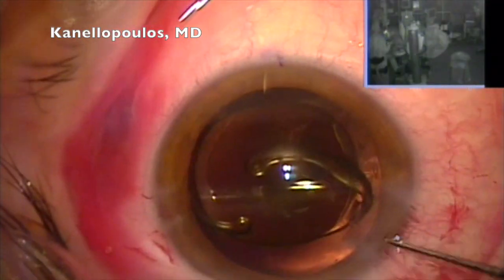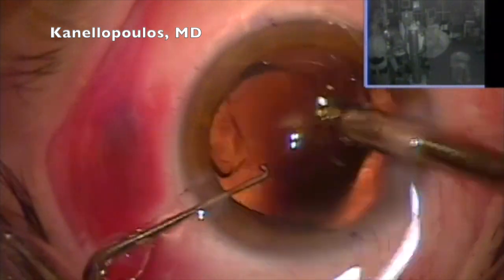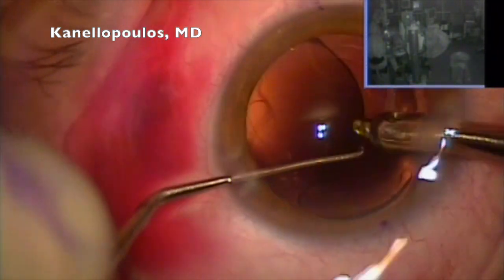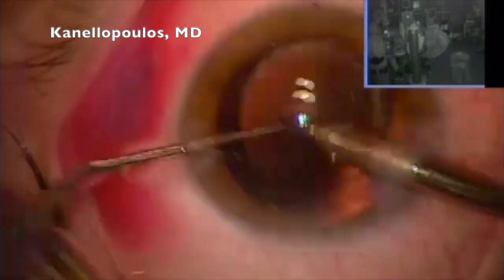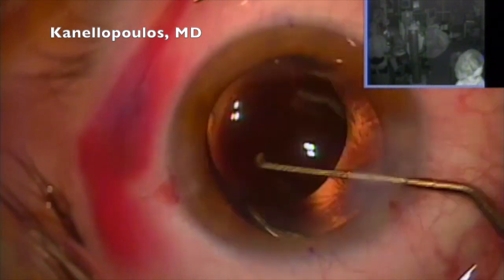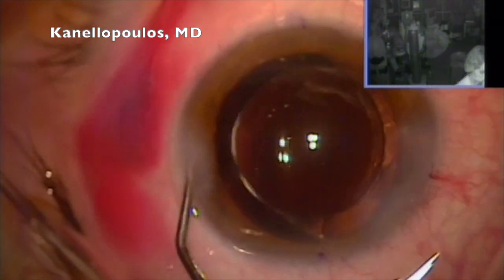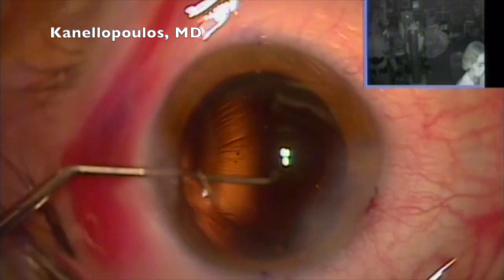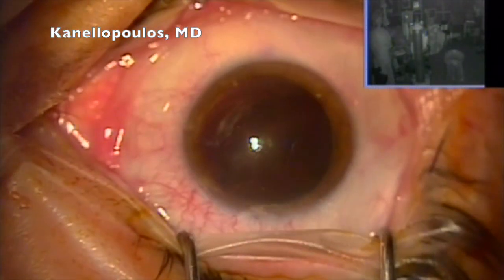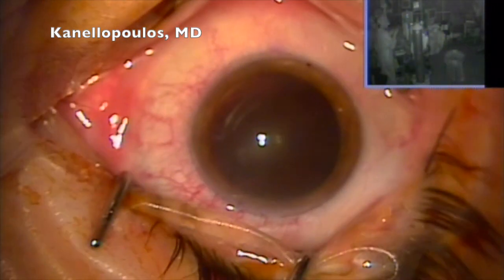Here's our toric lens for the left eye of this lady. We're aiming with monovision by targeting in all patients to be plus half with-the-rule post-op. We know that the post-op astigmatism is based on the keratometric astigmatism pre-op. We use the total cornea power. The IOL Master 700, by the way, is very good at giving total cornea power numbers, and we have been using this the last year as well. Perfect position, watertight incisions, good capture of the lens — T2 at a different position here, 60-something degrees.